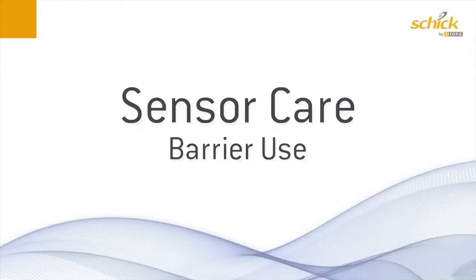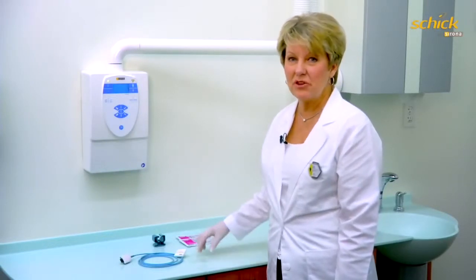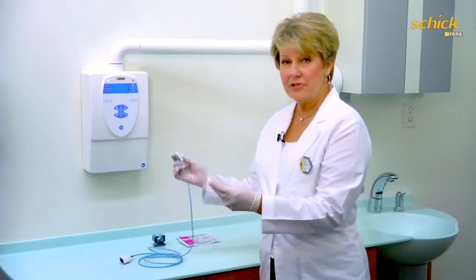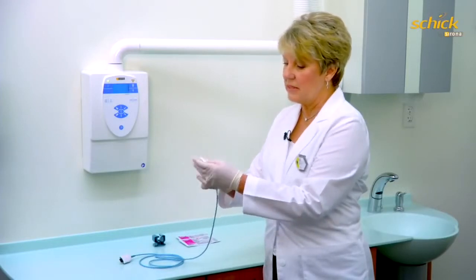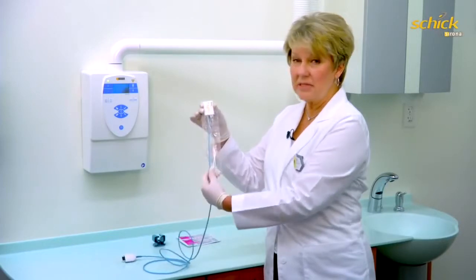Of your sensor is very important. We want to make sure that before the sensor is ever used in a patient's mouth, we cover it with a barrier. Use a recommended barrier for your sensor. Slide the sensor into the barrier all the way, pushing it all the way to the end of the barrier, making sure that the cable is covered as well.